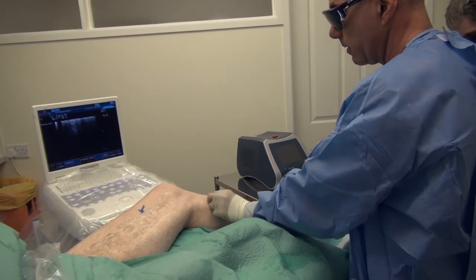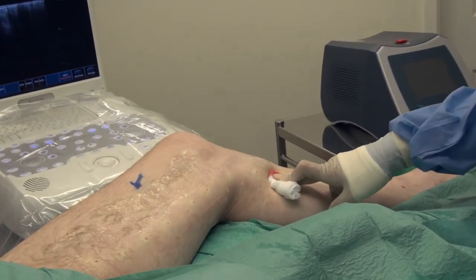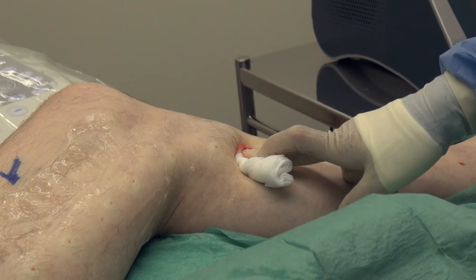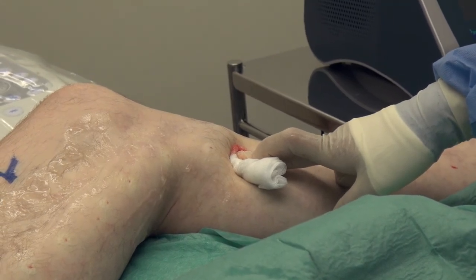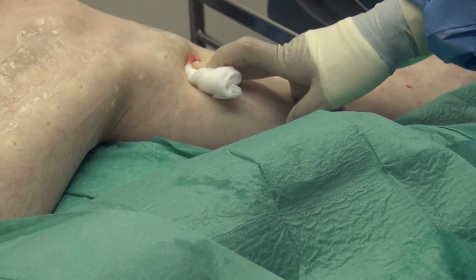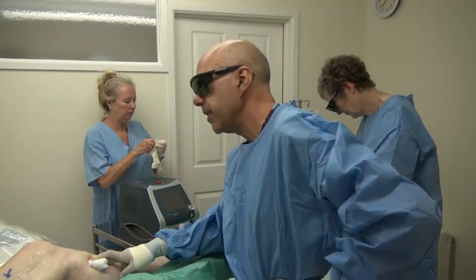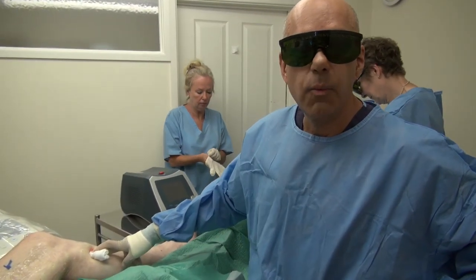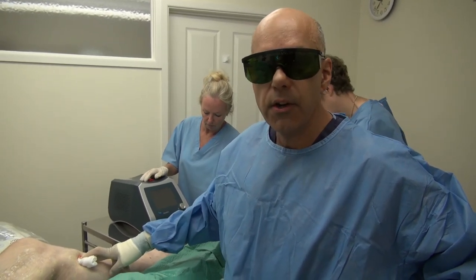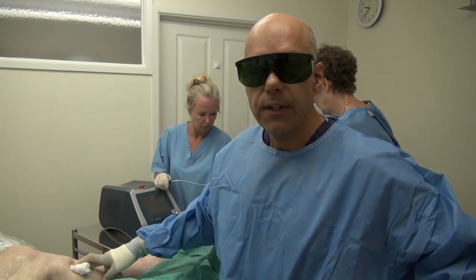This patient's procedure is complete. I'm going to apply a little bit of local pressure to the puncture site — and the patient is smiling off camera. I'm going to apply a plaster to this area and apply a compression stocking. The patient will probably wear the stocking for 48 hours, and thereafter he can wear it as he sees fit. Some people get on very well with the stocking and wear it for longer; some don't like wearing it and can take it off at that point.